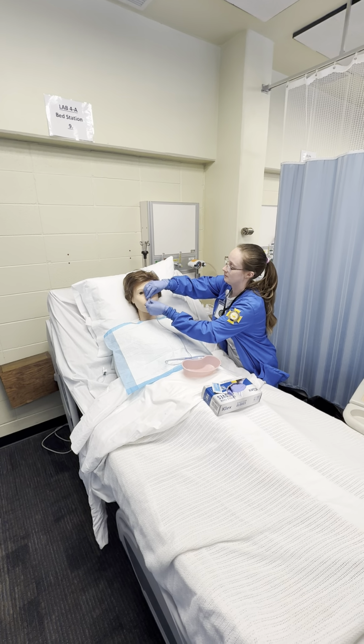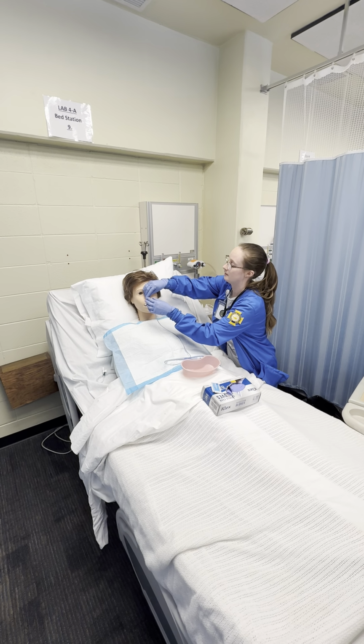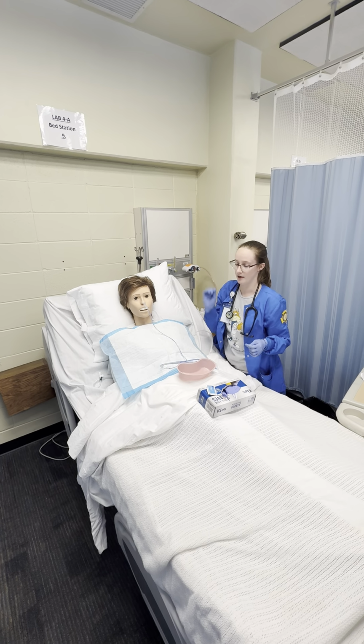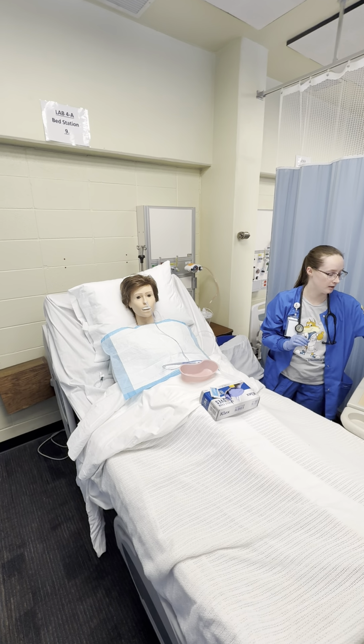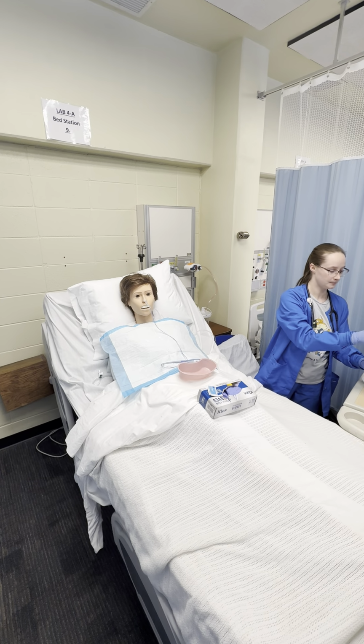Swallow. So loosely secure. Swallow. And then I'm going to check the stomach contents by aspirating some of the content from the tube. And then I pick a spot.